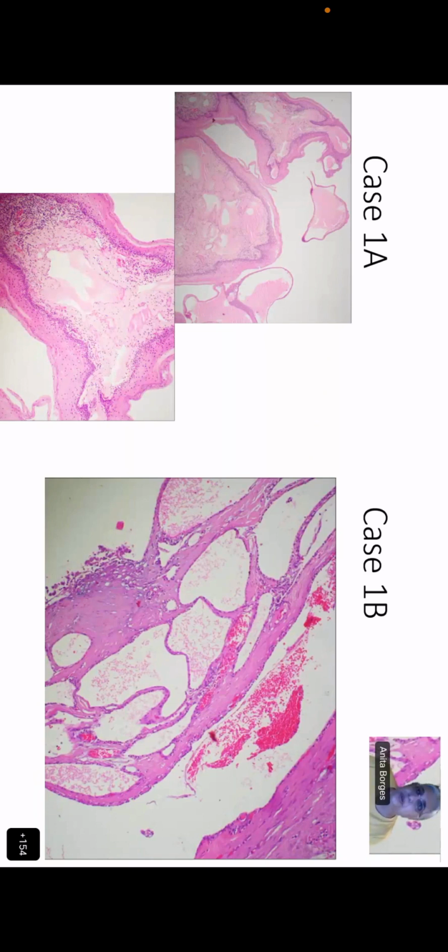So I don't know whether Limpy is there or not, but let me start with Dia. What is a secretion? Ma'am, secretion is a content inside a space which is released by the cells lining it. So you tell me what are these cells that release secretions?